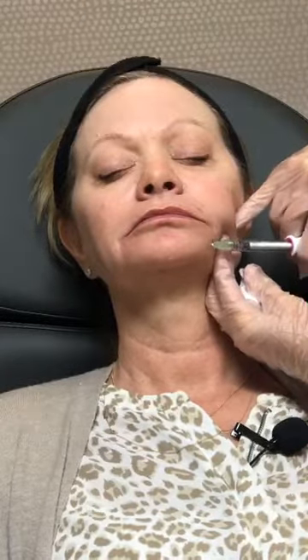Oh, my mom had it, so with jowls. Yeah, and probably what I should have done too, but sometimes when you're only doing 1 syringe, that's why 2 syringes is nice, because you have a little bit more leeway with Voluma. But next time we can put a little bit here too, and that'll give us some lift. I wondered if you could do that. Yeah, and I probably should have, but you needed it through here.